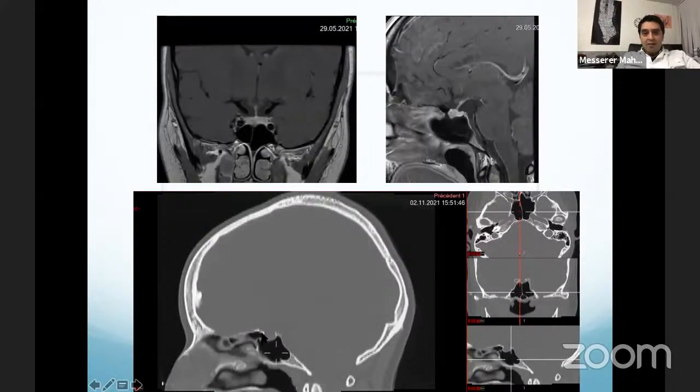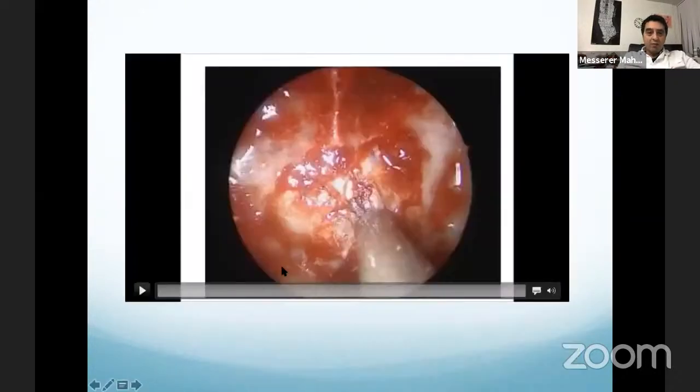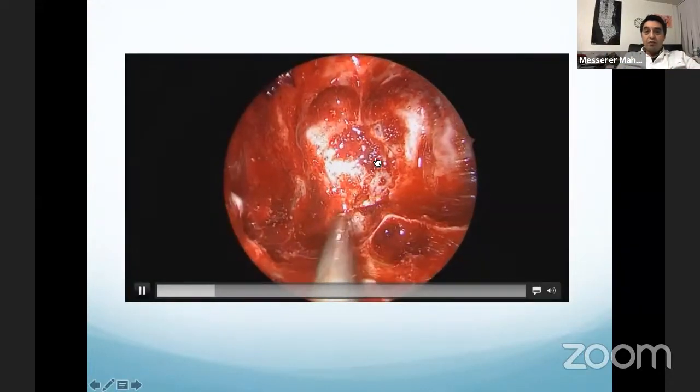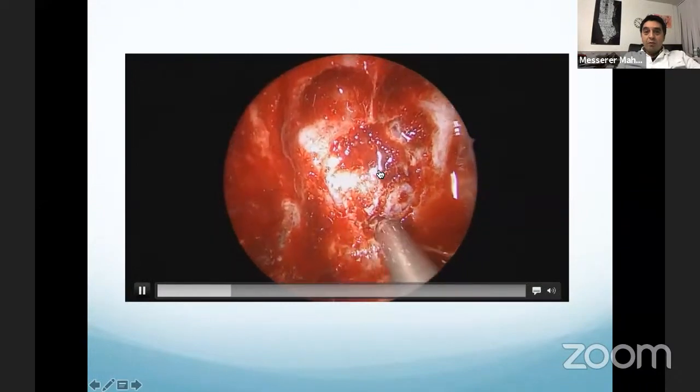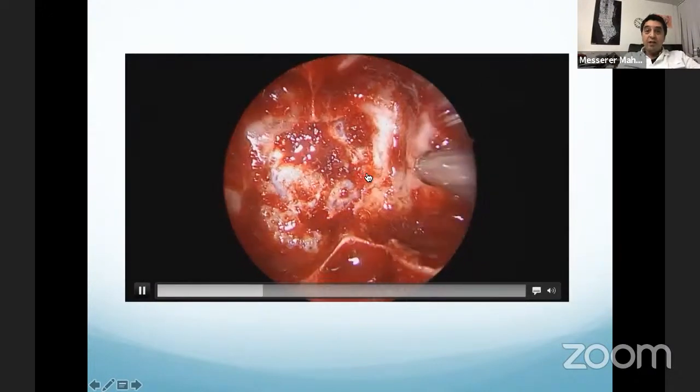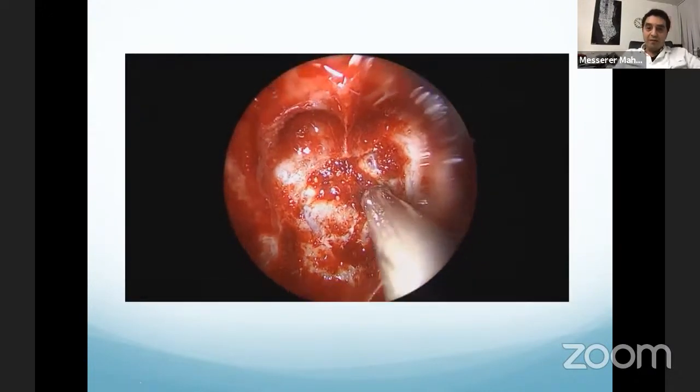The sella is a little bit upper and just behind the posterior ethmoid cells. I asked my resident, did you open the posterior ethmoid cells? He told me no. And immediately I knew there was a big mistake. I want to show you. This is not the sella, but the clivus. He opened more inferiorly, and fortunately, he stopped just in front of the dura. We can see the basilar plexus, and fortunately, there is no problem with the basilar artery.